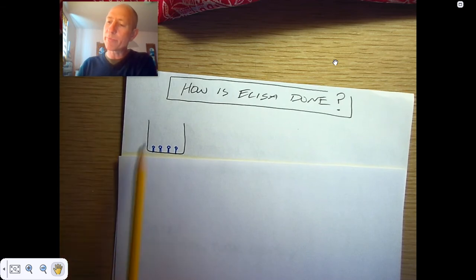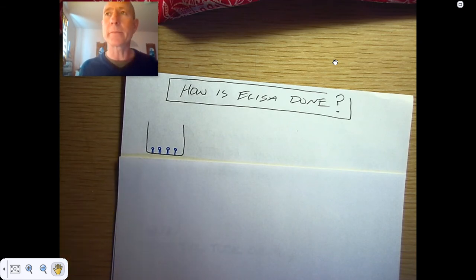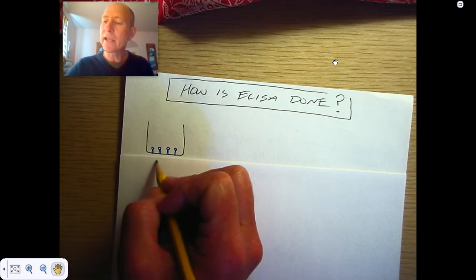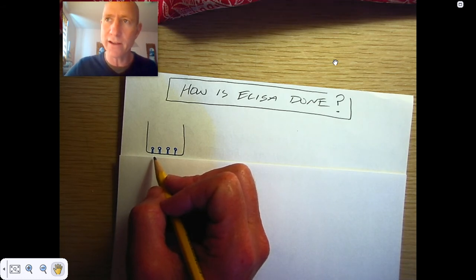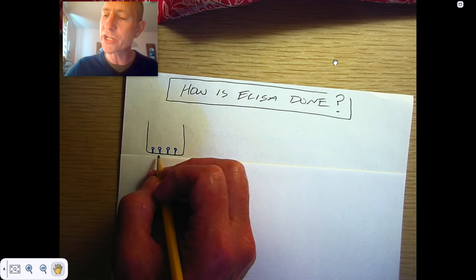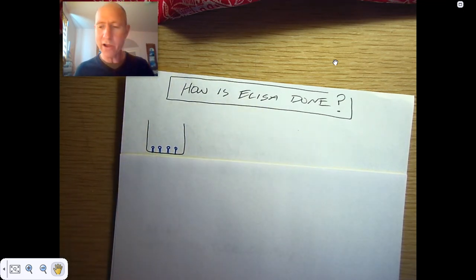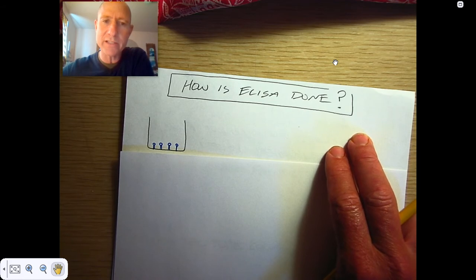So it starts with a plastic test tube, and just serendipitously, plastic binds proteins really well. Plastic and proteins have electrical properties that are complementary to each other, and proteins stick to them. So you can take a plastic test tube and you can treat it with spike protein from coronavirus. So you can just get a bunch of coronavirus in the lab, chop it up, separate the spike proteins from the other proteins with chromatography, put it into the test tube, wash it around, dump it out, and the spike proteins are going to stick to the plastic. They'd also stick to the walls over here also, but I just wanted to keep it sort of not cluttered. So here we are with our plastic test tube with coronavirus spike proteins.